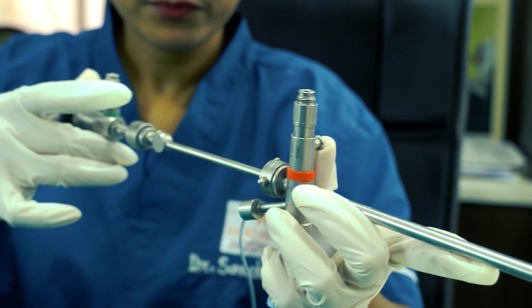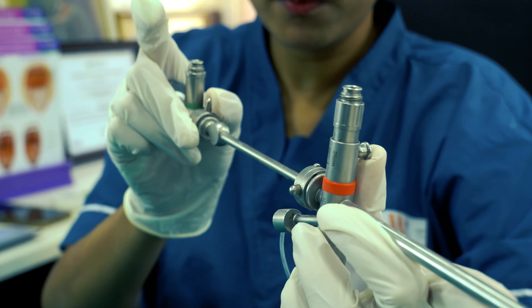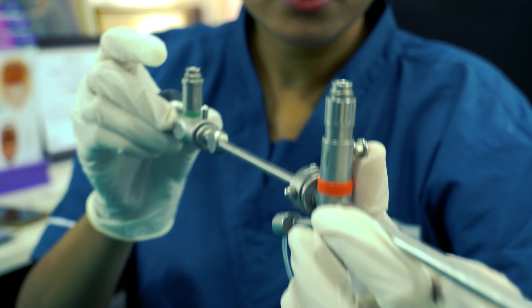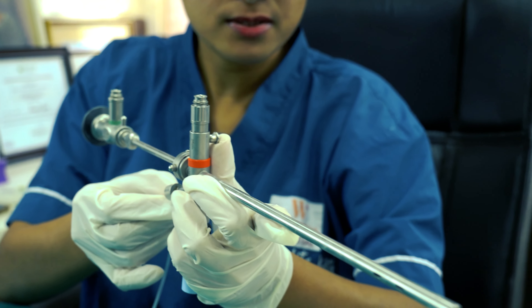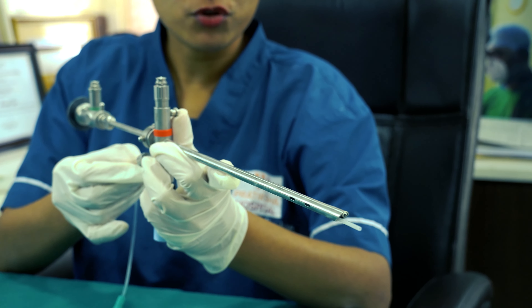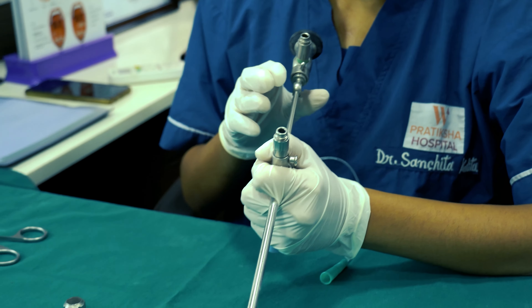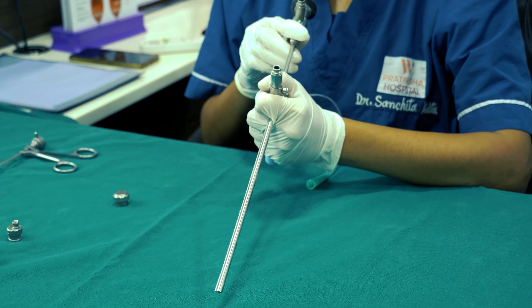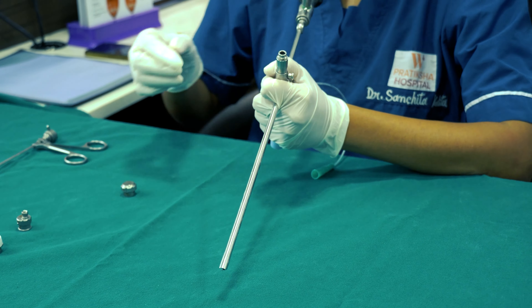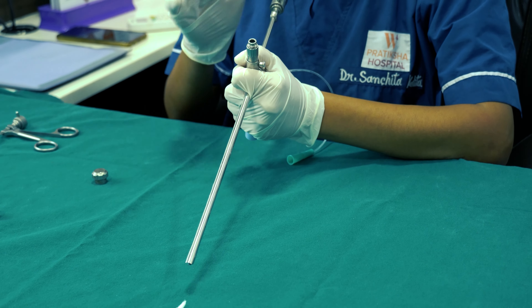During introduction we have to again make sure that this prism is just slightly slid upwards so that we can easily introduce the scope. Fit it this way and then just move this knob upwards — now this is closely fitted. Along with the scope we can see that the suction is also coming out through the distal end. Now this assembly is perfect for diagnosis of any foreign body in the bronchus.